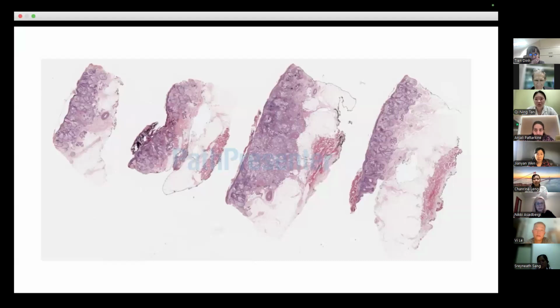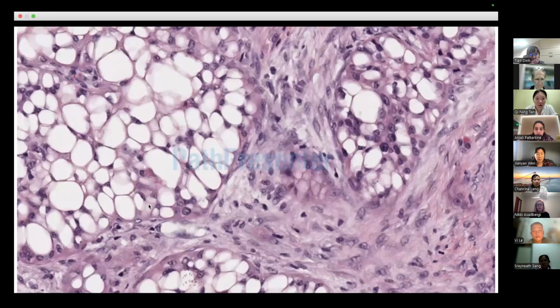Melanocytes can have a little bit of a halo. BCC can actually have some clear cytoplasm too. In some cases, you can have a little bit of clear cytoplasm around it. But if you, Angela, can you go to the higher power? So for BCC, most of the time when you're having some clear cytoplasm or white space, you're having it around the nest because that's a clefting artifact.